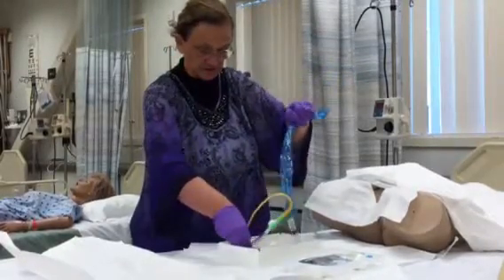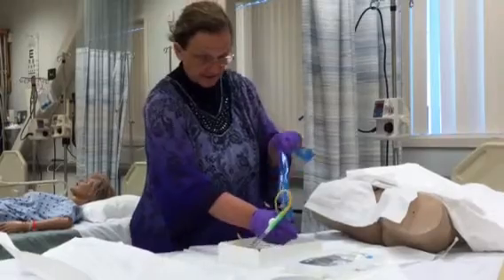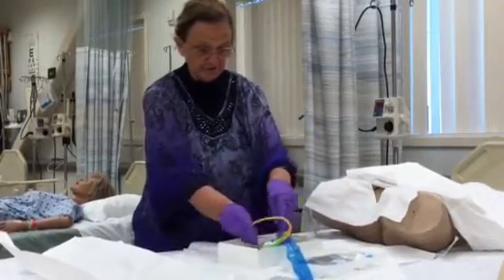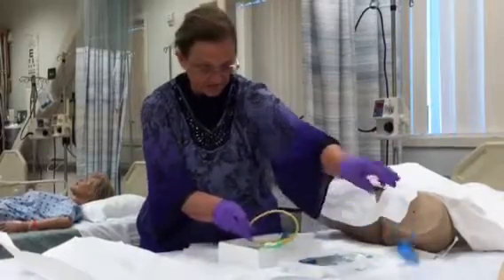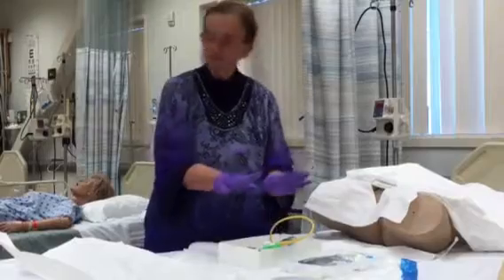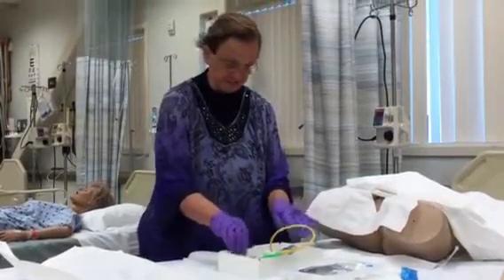The catheter did not touch the bed. If the catheter had touched the bed, I would have had to get another catheter, okay? So I salvaged that. Alrighty, so I know my balloon works. I've got my syringe attached, correct?